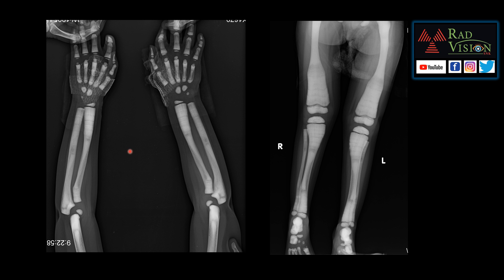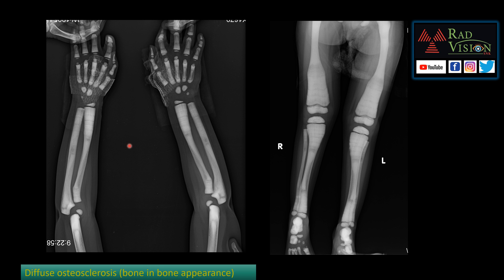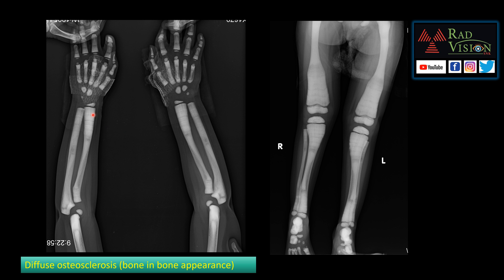Coming to the first case, you can see typical diffuse osteosclerosis of the long bones. There are growth arrest lines and the typical bone-in-bone appearance. Even the Erlenmeyer flask deformity involving the meta-diaphyseal region of long bones — both femur and tibia — can be seen.